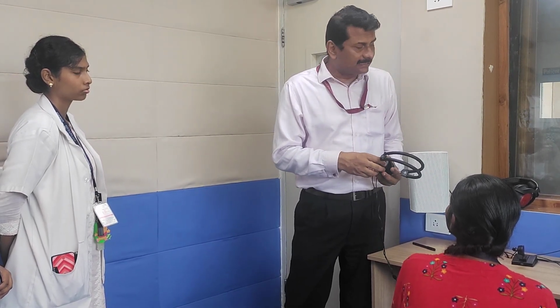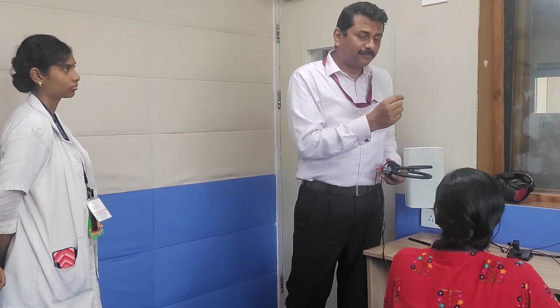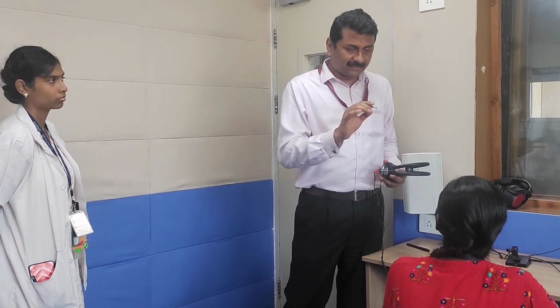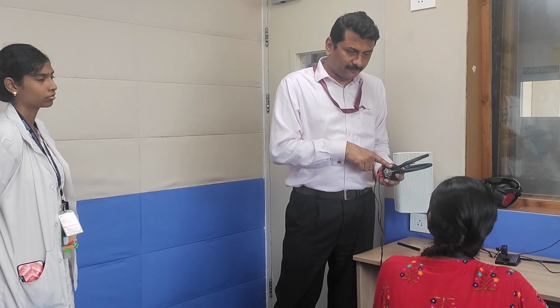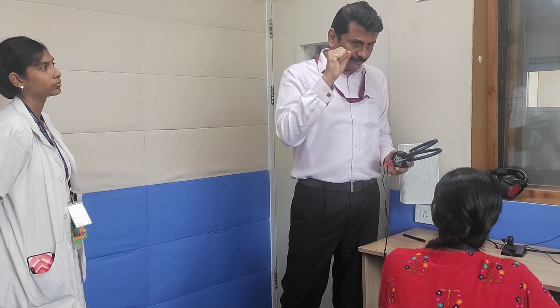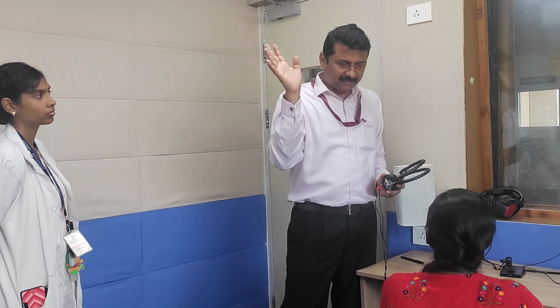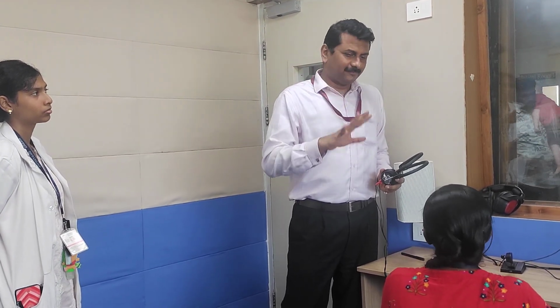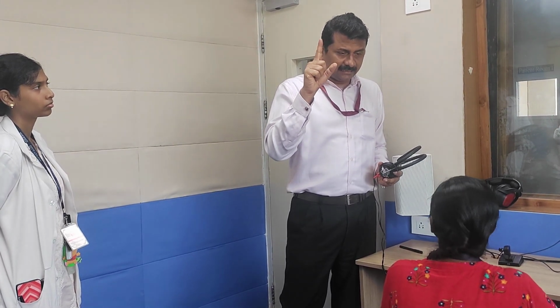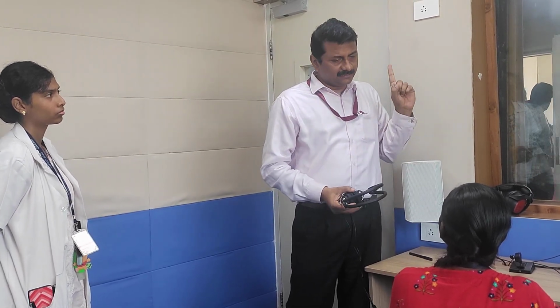What is going to be done is, I'm going to give some noise or some tone, which will sound like whistles. Ding, ding, ding. Something like this, like whistles, which will be given through these headphones, one at a time, remember. The moment you hear a sound or a pure tone, you have to put your fingers up and then down. You don't have to do like this. You hear it, up, down, heard it, gone, heard it, gone. Clear? When the right ear is being stimulated, right ear. When the left ear is being stimulated, left ear.